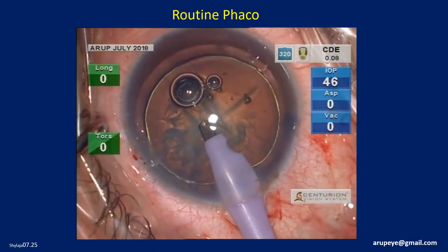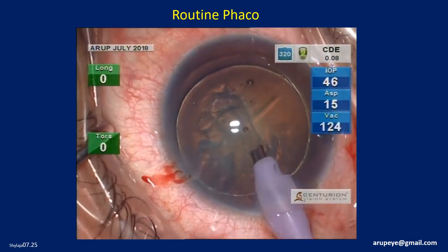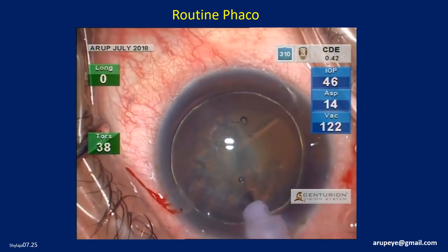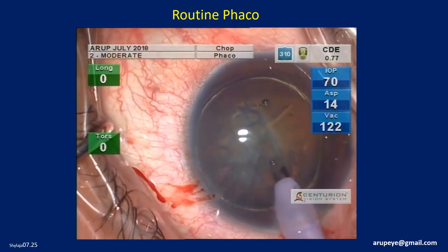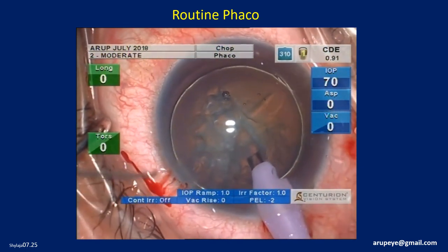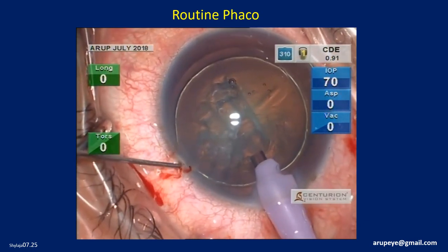Phaco is then initiated with the sculpting settings. This is a sort of warming up before the main game of nucleus management begins. The phaco parameters are then changed to allow safe chopping to take place.